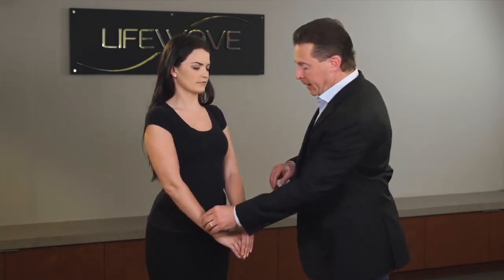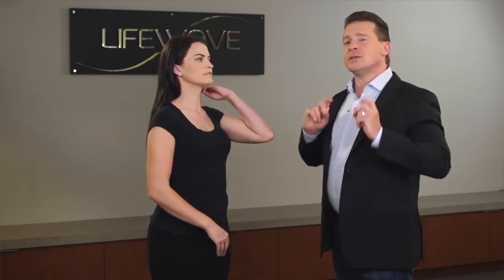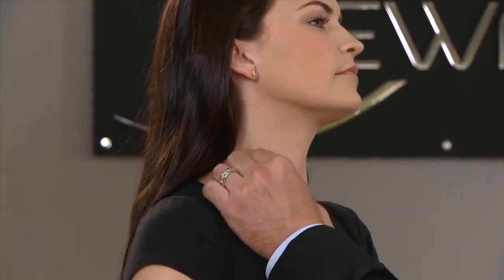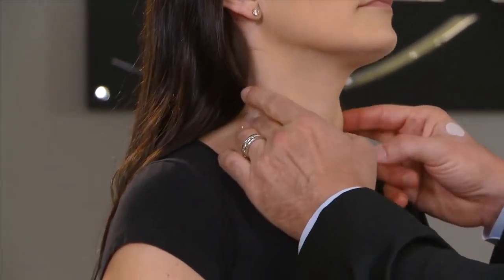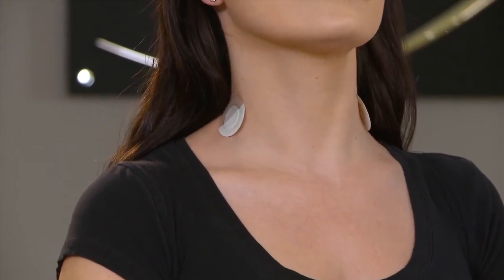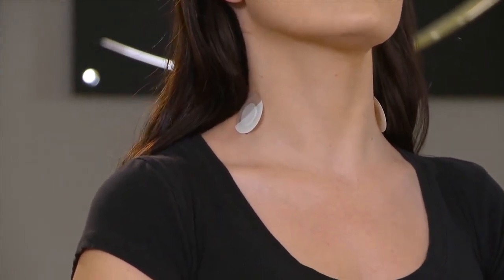Now we know that when people have headaches, they carry a lot of tension in their neck and shoulders. So why don't we try applying the patches to one of the points along the neck. Now, the good thing about this location is that it's really easy to find because you can really use any points along the sides of the neck. We can just start at the base of the neck like that and apply the white patch to the right side of the head and the tan patch to the left.